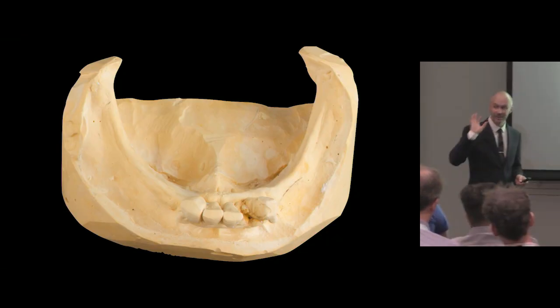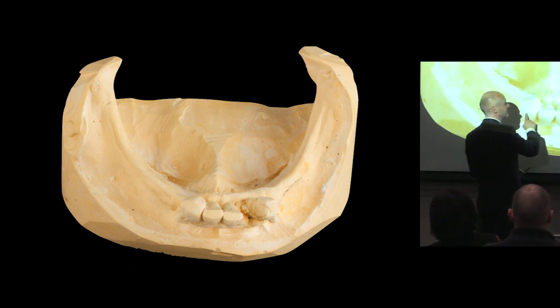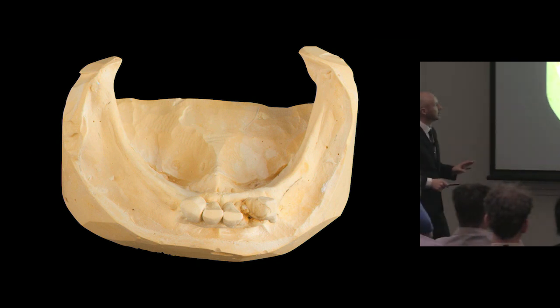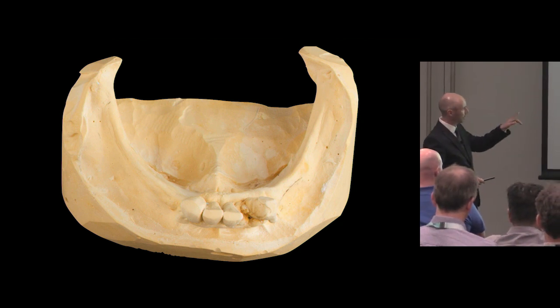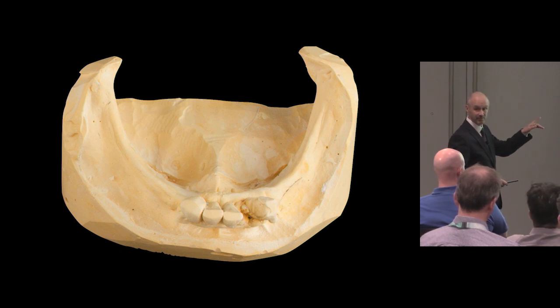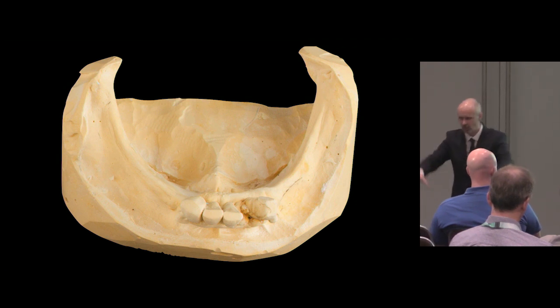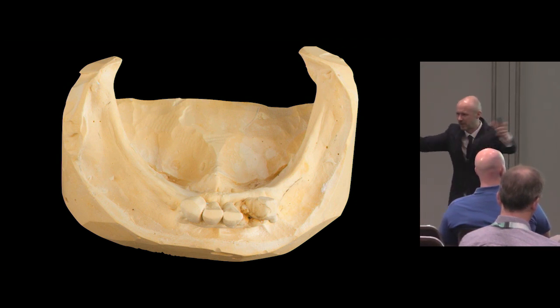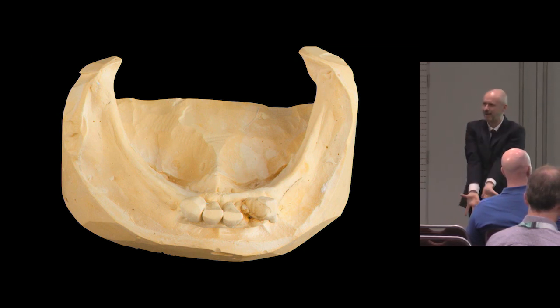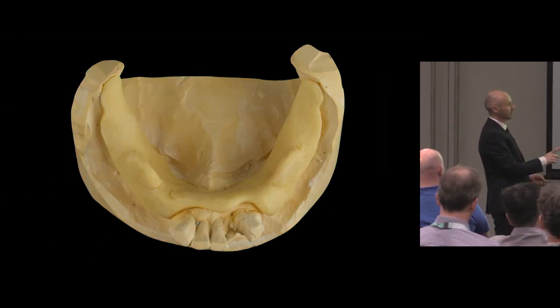So I'm going to make an immediate denture for him. These teeth at the front here, those 5 anterior teeth, are going to come out. To get a really great primary impression, I need to have it overextended because I want to make a special tray on that. So it's like a big lump of alginate. I want to get the retromolar pad, the buccal shelf, the lingual shelf, the whole lot captured there, and that allows us to make the special tray.